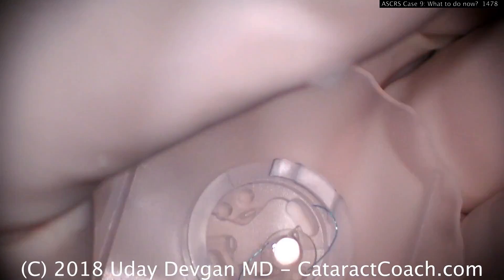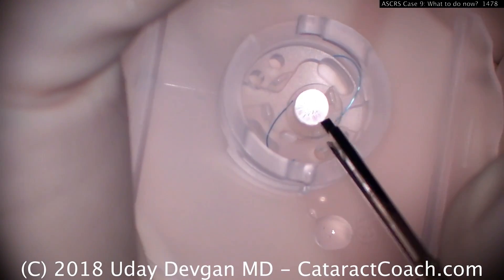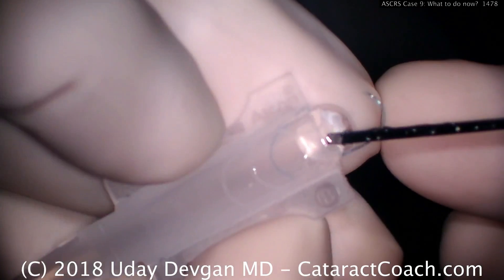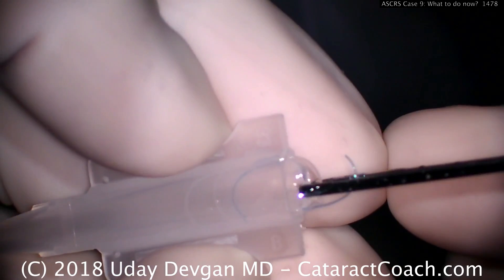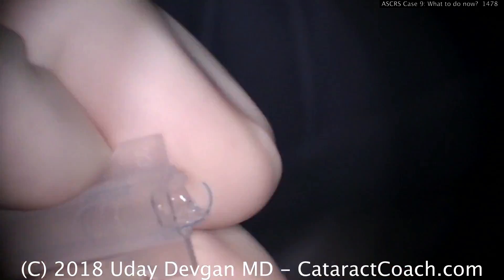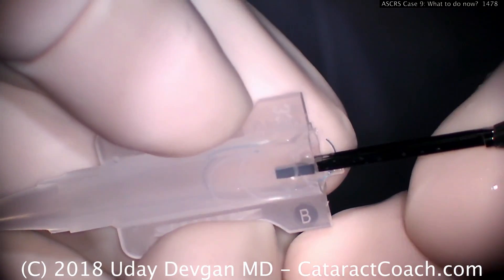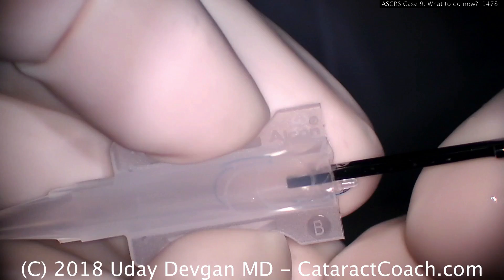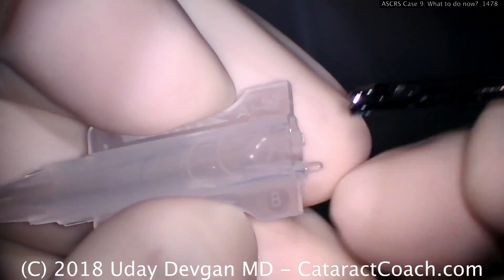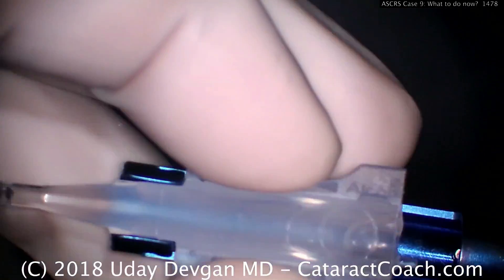Now the same situation with another three-piece lens — same design, same manufacturer. Let's load it and confirm the anti-S orientation, which matches the picture on the cartridge. Advance it down — same B cartridge, nice and easy. It's actually the same power as the patient's other eye, leaving a little mild myopia for each eye. Advancing it — it looks perfect right now, but watch what happens.